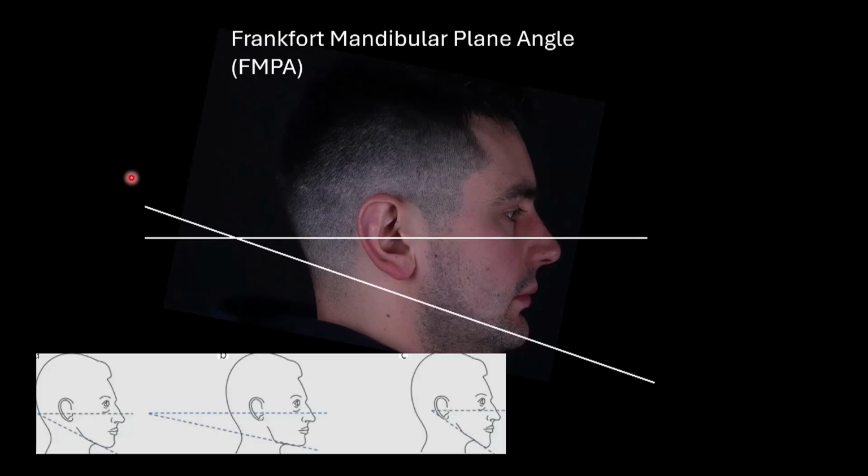So you're just going to draw two intersecting lines across the face, exactly as we've got down on the bottom here, and where they intersect tells you if it's low, or if it was normal and it would intersect around here, or if it was high and they would intersect around about here. And the only significance of this is that if it's a high case, if they're intersecting around about here or beyond, then you might want to consider referring that on. That's called a high angle case.